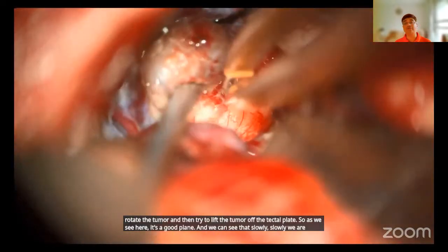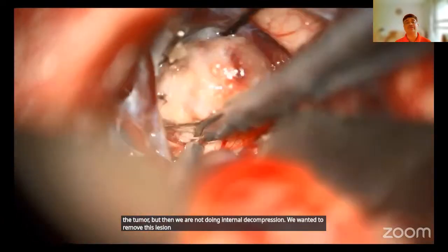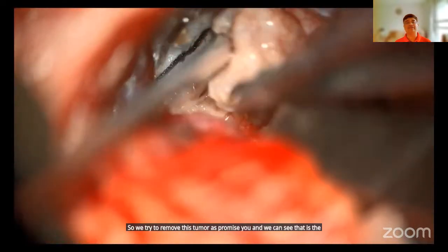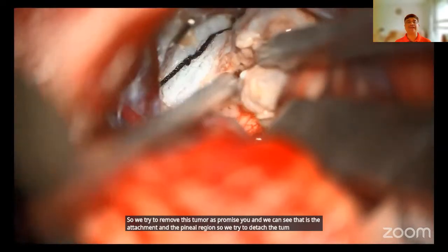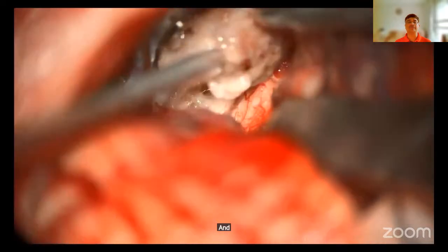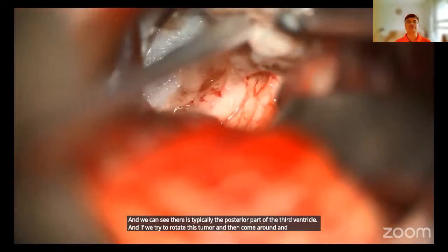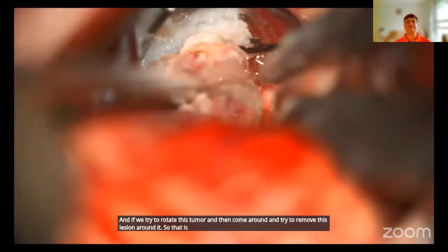But we are not doing internal decompression. We wanted to remove this lesion en masse because this is not a very big lesion. So we try to remove this tumor progressively, and we can see that is the attachment from the pineal region. We try to detach the tumor from the pineal region, and as we do so, we are opening into the third ventricle more and more, and that is typically the posterior part of the third ventricle. Then we rotate this tumor, come around, and try to remove this lesion. So that is the structure where it is attached, the pineal region.